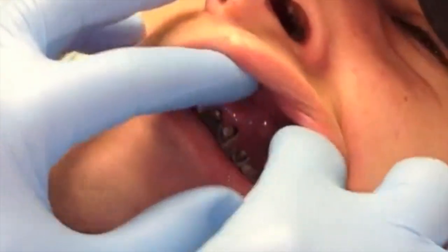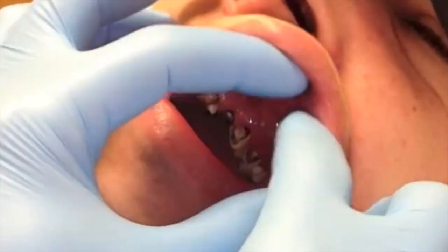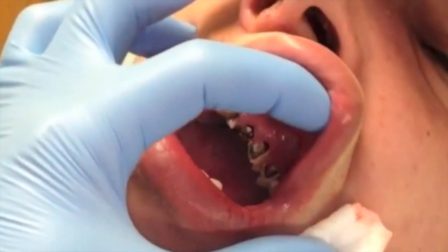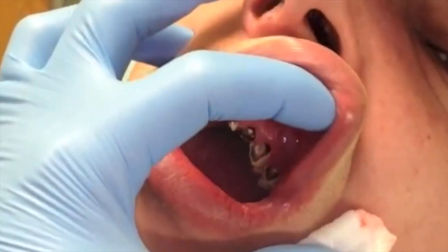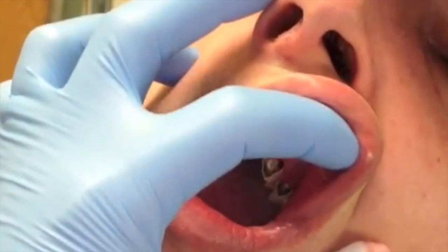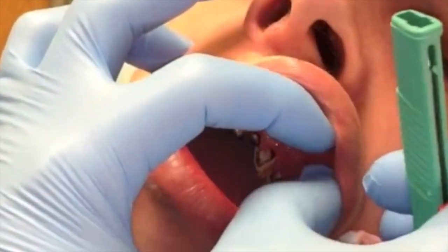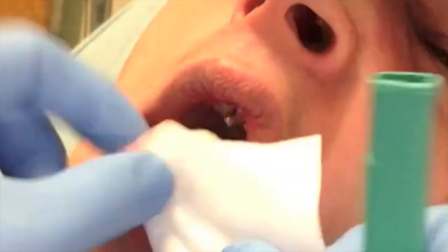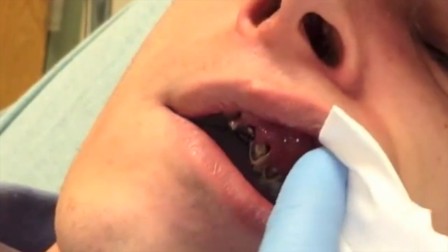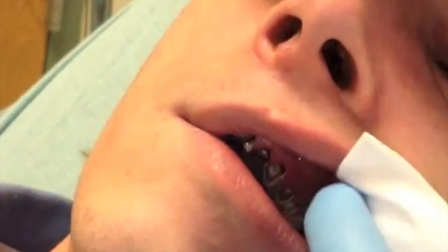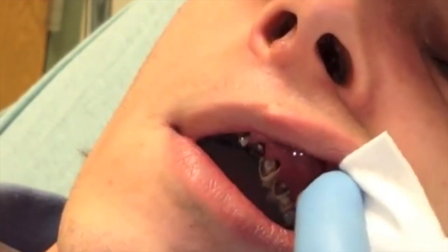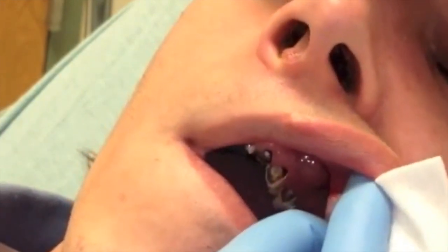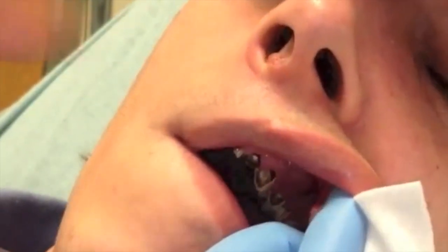You can see the second injection was a lot better tolerated. Now I'm pushing on it with my finger, making sure it's nice and numb. Eventually the patient even checks on the outside to make sure he's numb, and I'm checking to make sure there's no other pain anywhere else. It's kind of difficult to hold the lip up, so I'm using the gauze to give me some traction and access into that abscess of the upper gum on this patient.